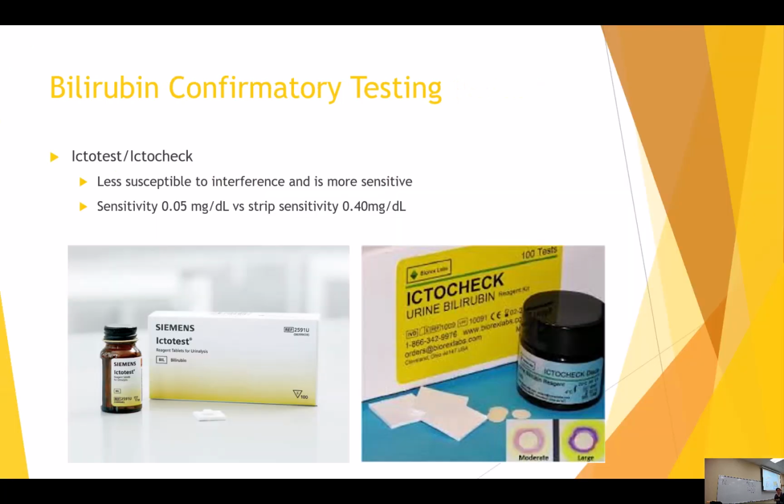For bilirubin, we do have a confirmatory test, an Ictotest or an Icto check. For a while, we weren't able to get the material to make Ictotests. They became unavailable for quite a while. Another company came out with this Icto check. Ictotest is less susceptible to interferences and is more sensitive. The normal sensitivity of a strip is about 0.4 milligrams per deciliter. The sensitivity of the Ictotest is 0.05 milligrams per deciliter, so quite a bit more sensitive. So if you think there might be some bilirubin, the bilirubin pad is positive, but you really don't know if it's a color issue or something else is causing the problem, we can do the Ictotest and determine if bilirubin is truly there or not.